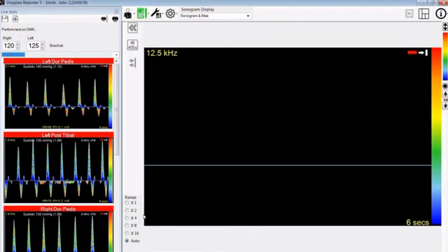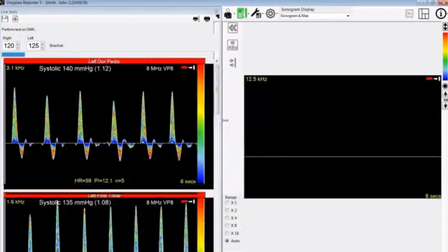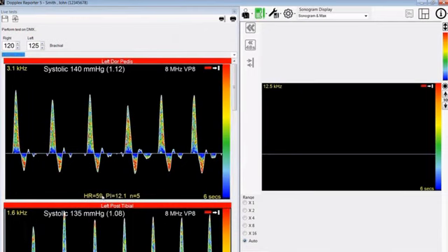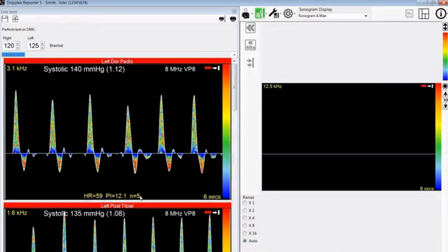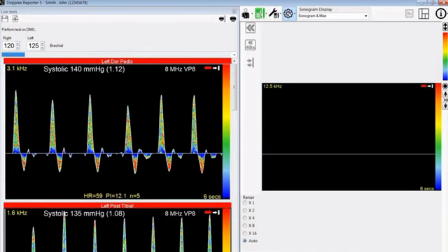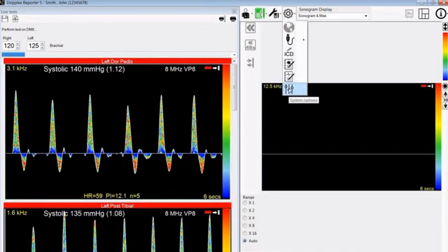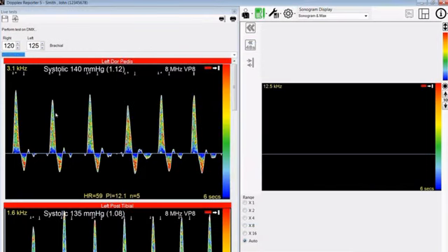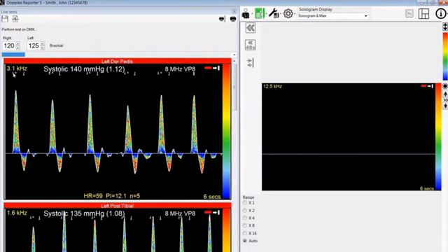Press OK. We can then click and drag across to review the results very clearly. Heart rate being 59. Pulsatility index is 12.1 and it is an average of 5 cardiac cycles. The 5 cardiac cycles which have been used are complete cardiac cycles and can be shown by going to system options, trace tab and selecting show calculation markers. These calculation markers show the short one being the peak systolic point, the middle length one being the start of the waveform, and the long one being the most negative point in the reverse flow.